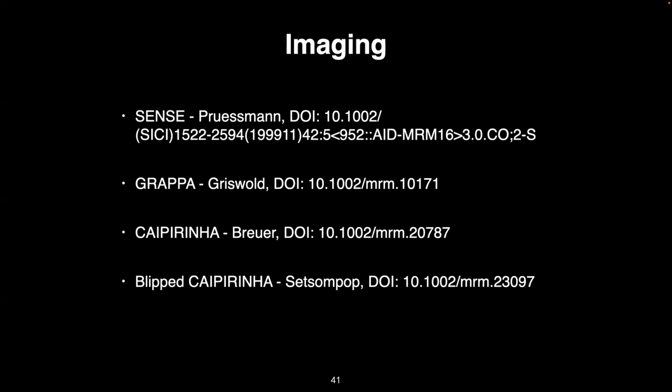So there's a comment in the room that the currents induced by gradient switching are at least an order of magnitude less than what it would take to induce any kind of cardiac event or any other kind of neural event. Any other online question?